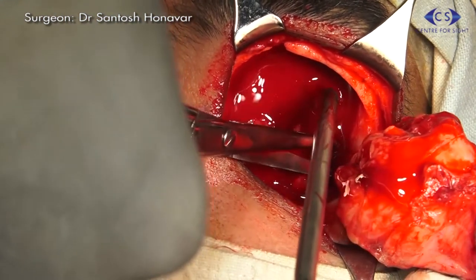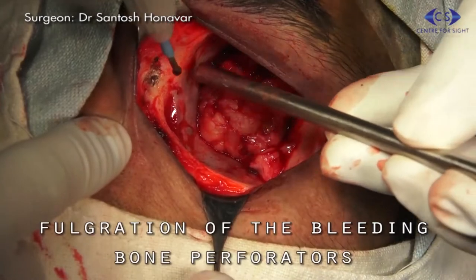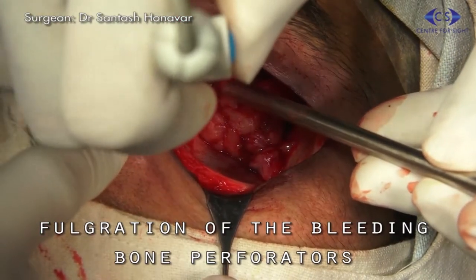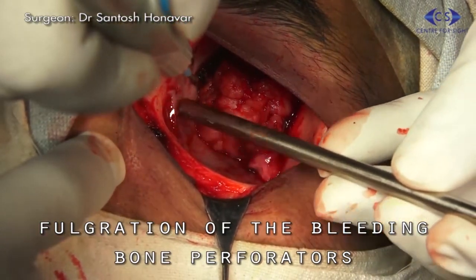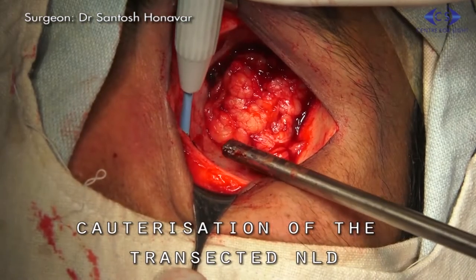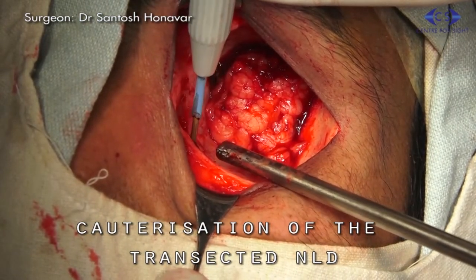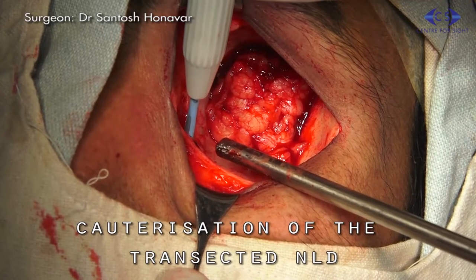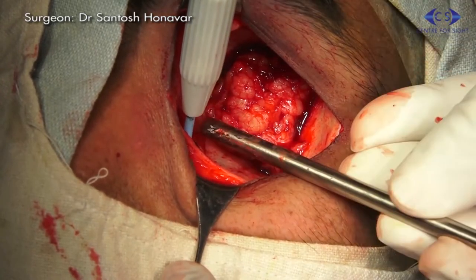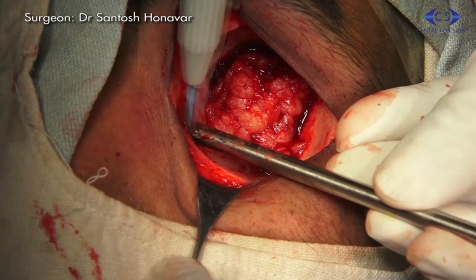Hemostasis can be obtained with ice-cold wet gauze, pressure, and cautery. The exposed nasolacrimal duct is obliterated by cautery to decrease the risk of postoperative fistula formation. If necessary, additional hemostasis is achieved with Surgicel or bone wax.